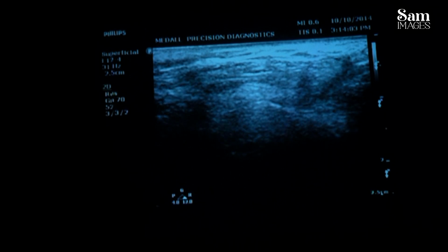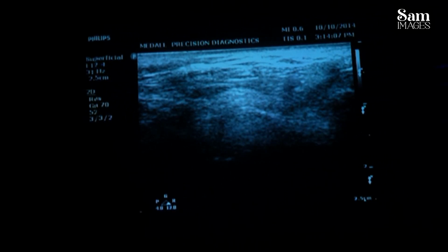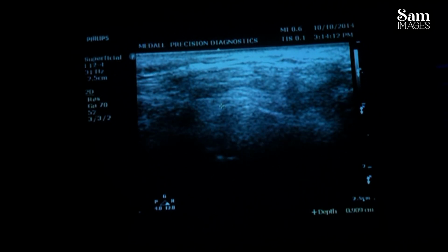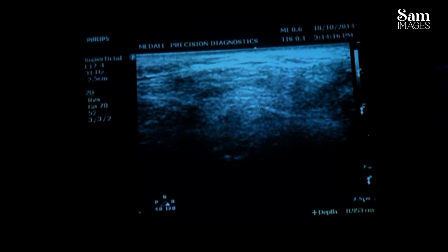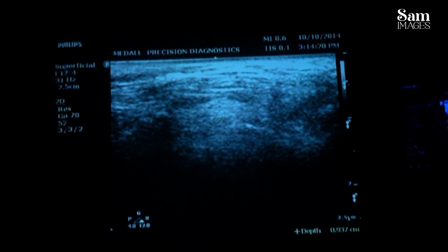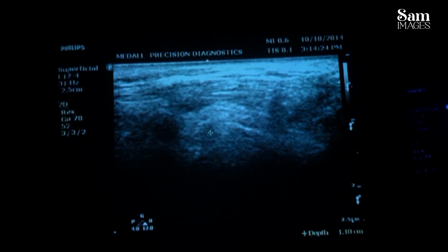See, the contour is not smooth at all. Cursor, you just show me. No, pointer. That one, you see that it is not smooth at all. That is irregularity. Can you see that the irregularity is there? See, restriction is there, not like that previous one, normal and steady.